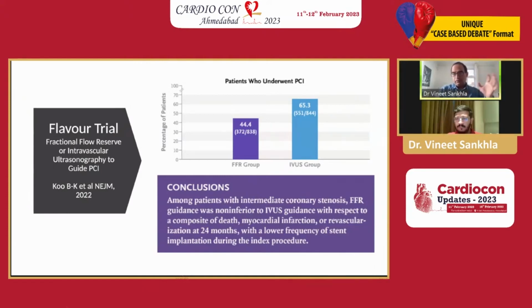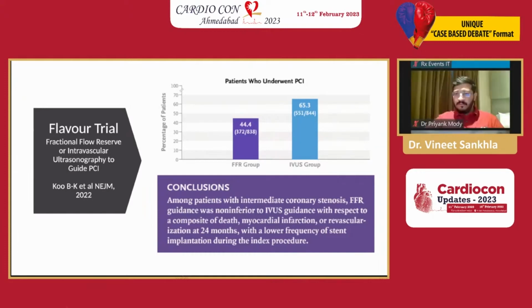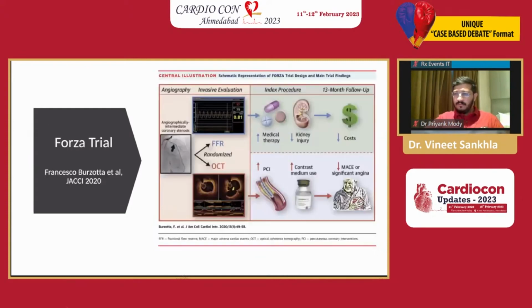So that is the greatest benefit of physiology, which I think is much better as compared to imaging. And this was a landmark trial, the FLAVOR trial, which was published in NEJM.